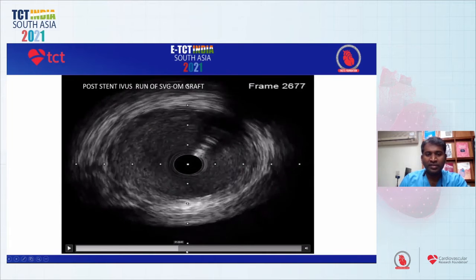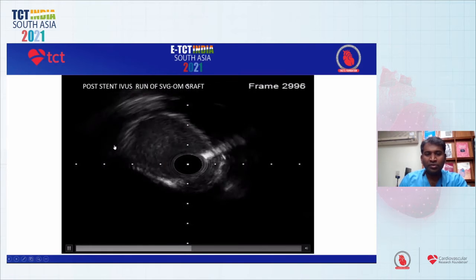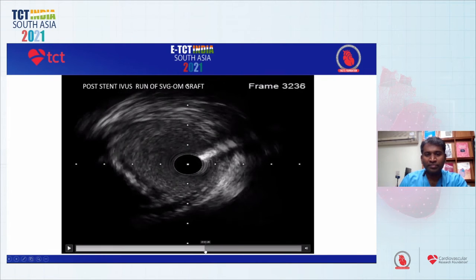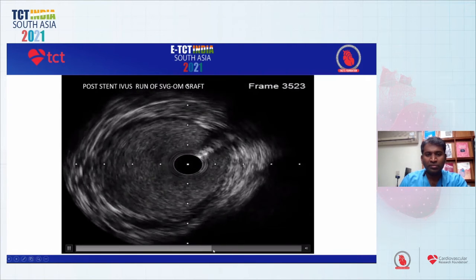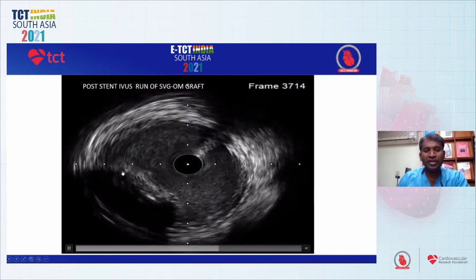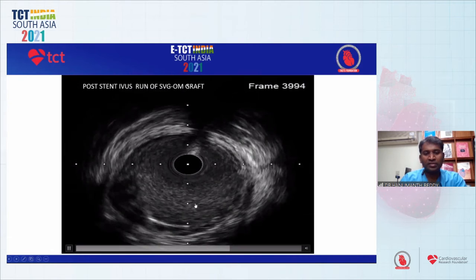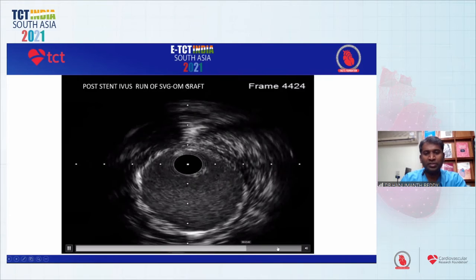Concentrate at this area. Coming still proximally, where you can see at the 7 to 10 o'clock, there is a calcified plaque, and the lesion looks like it is still coming proximally. Where you can see a haziness suggestive of a thrombus from 6 to 10 o'clock position, just after the distal edge of this proximal stent, and the stent looks mildly underexpanded and opposed.